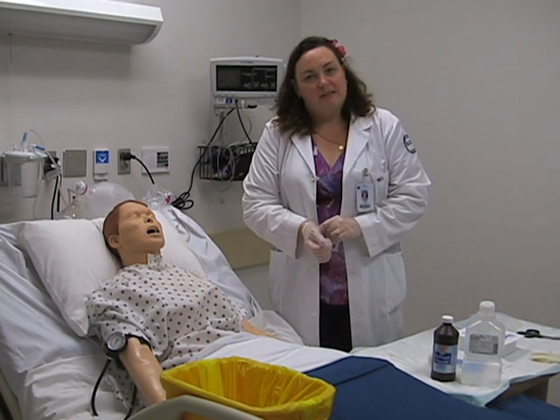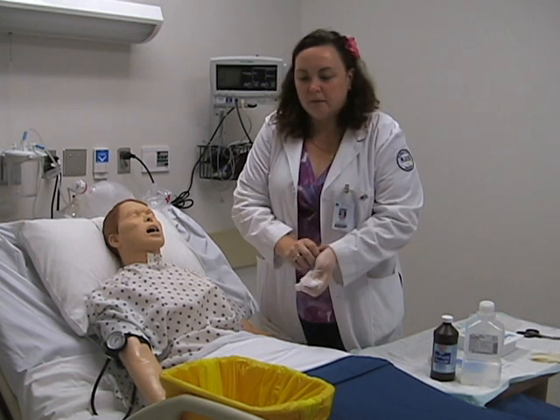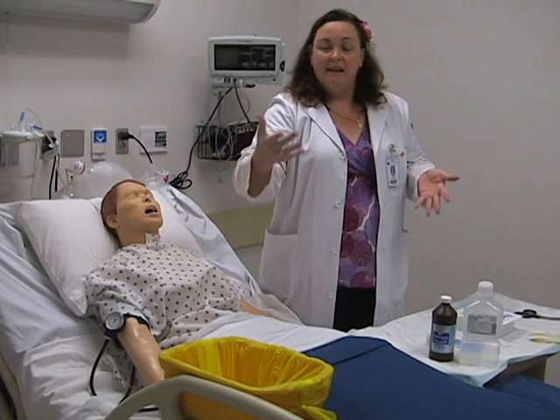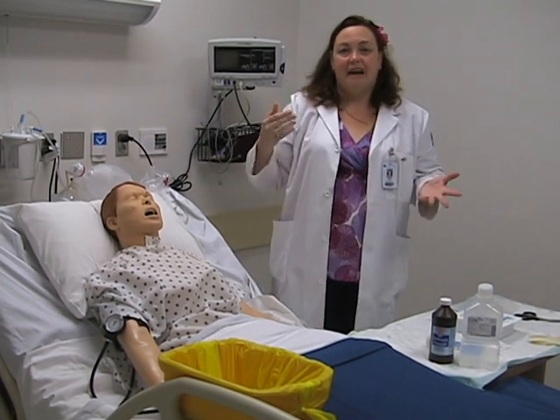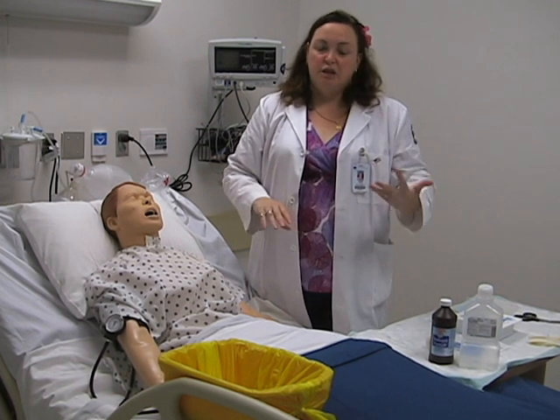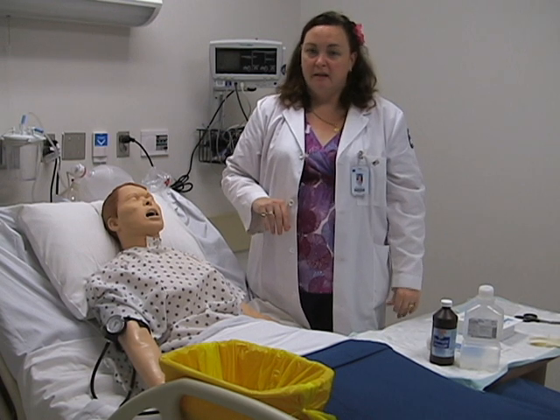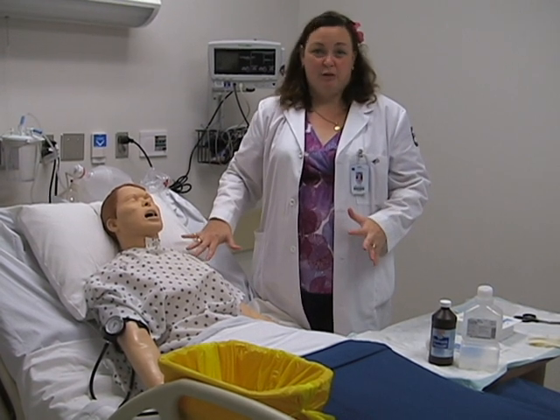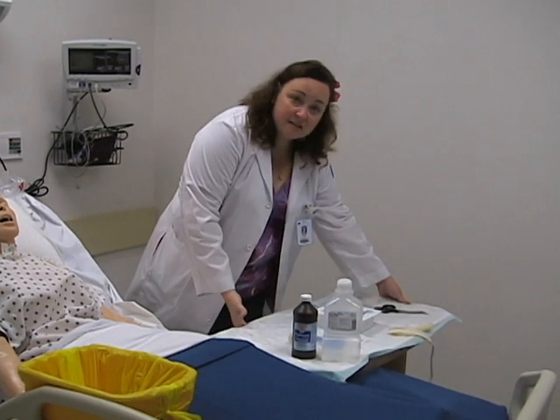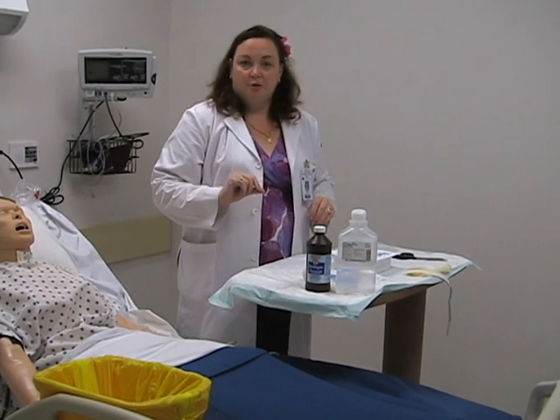So we're going to get ready to do the tracheostomy care — we're going to be changing out the inner cannula. Some nurses will do this with the table up over the bed, but if you have a patient who's confused or has issues with staying still, they can accidentally bump the table and everything can fall off. It also makes the patient feel a little claustrophobic. I like to put mine to the side and raise the table to a level that is comfortable for you.